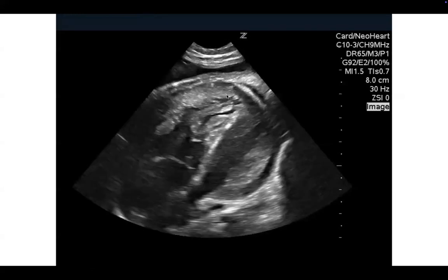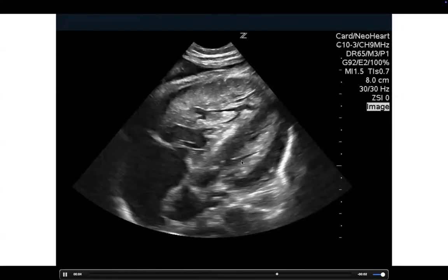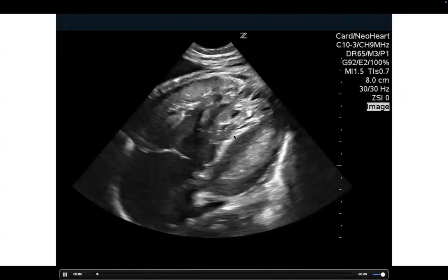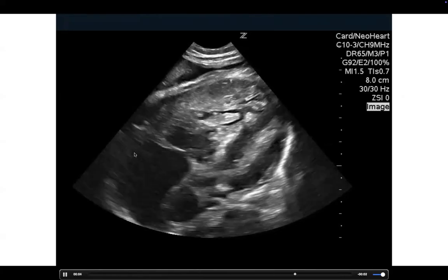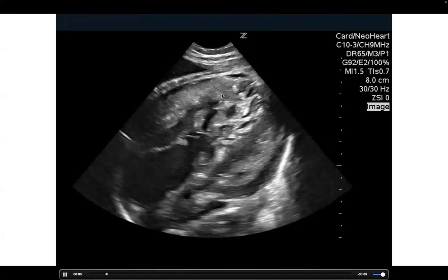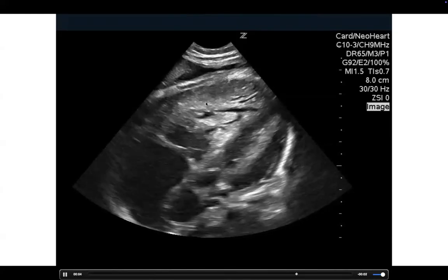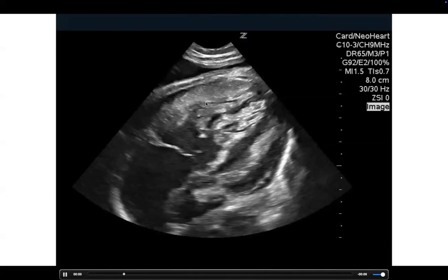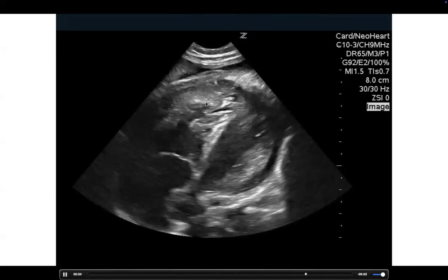This is a sort of a subcostal view. Again, you can see the RV on top, and then you've got this very squished LV. So very, very abnormal. Like you can see how thick the RV wall is here. Really interesting. And this obviously changes the dynamic. And that's kind of the point of this technology when used in the critical care unit.